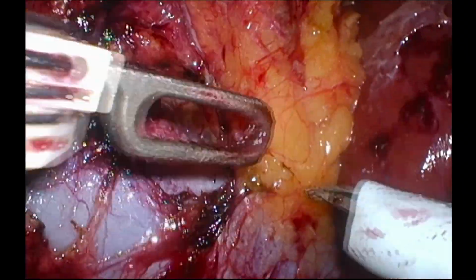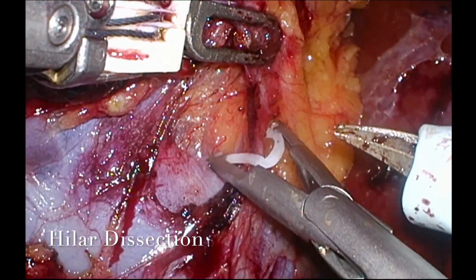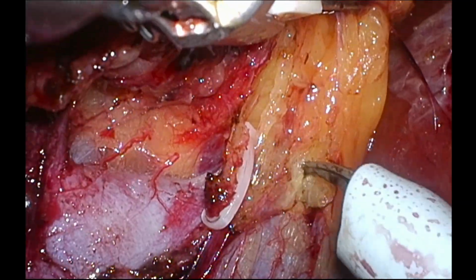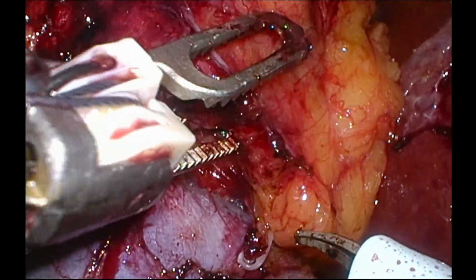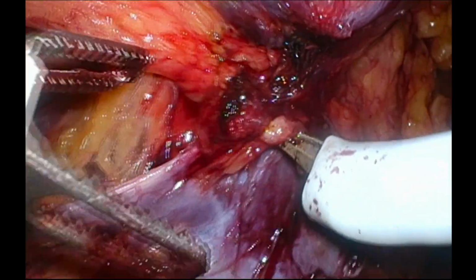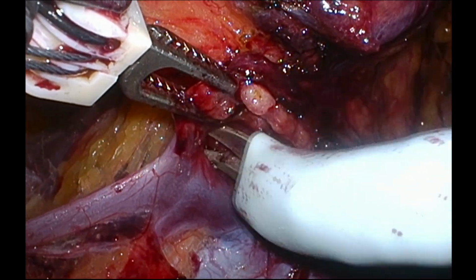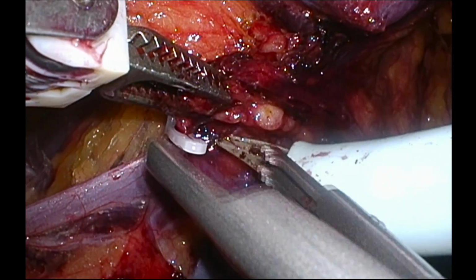On approaching the hilum, renal vein is visible. Some accessory veins need to be clipped and divided between the clips. One can appreciate one vein draining into the gonadal vein. The vein was dissected and cut between the clips.